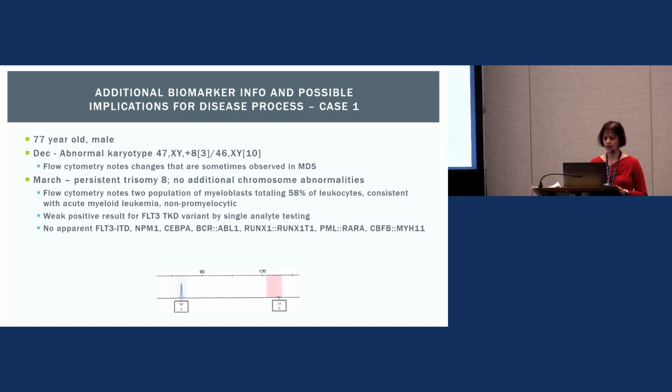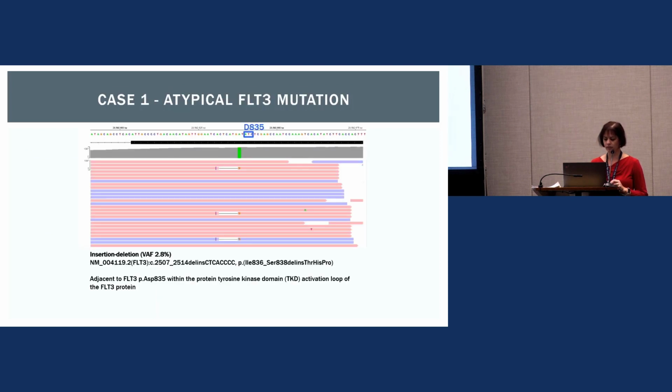So this is a restriction enzyme assay that we do to target the tyrosine kinase domain to see if they have variants of that particular domain. And we do know if there are variants present, then there are therapies available that can be used to target that. When we did the NGS sequencing, however, it was a very atypical FLT3 mutation of the tyrosine kinase domain.